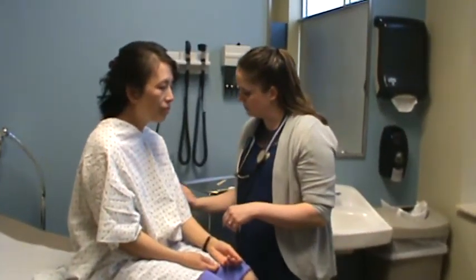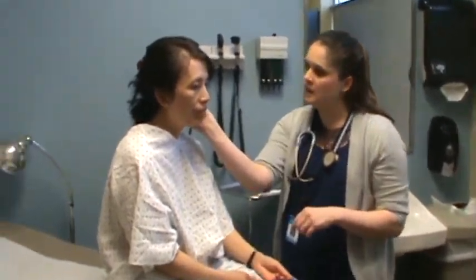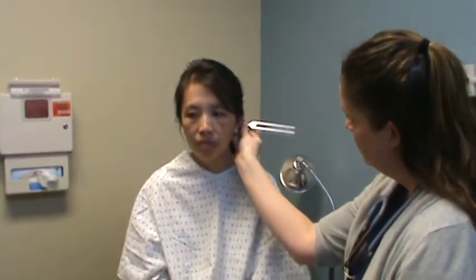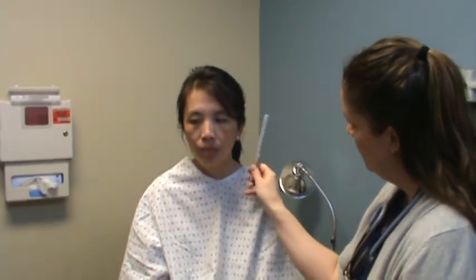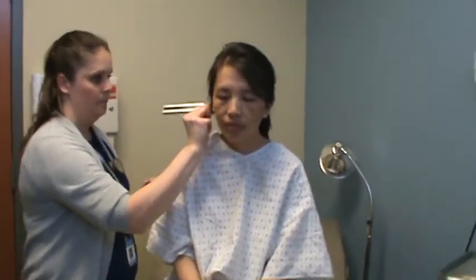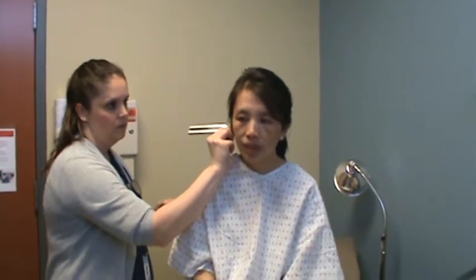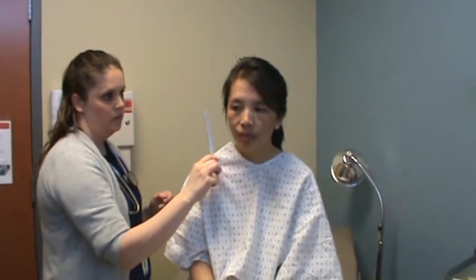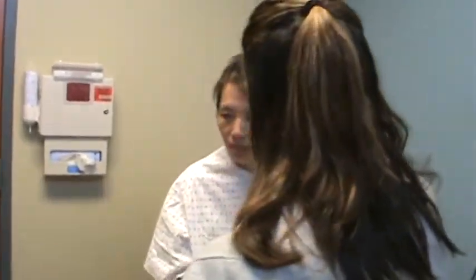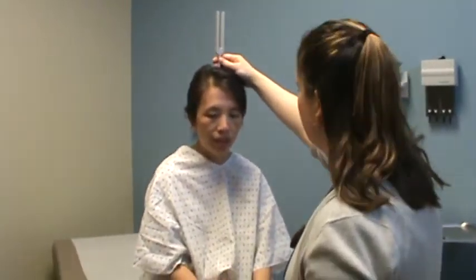And we're going to do a Rinne test now. I'm going to put this tuning fork up to you, and I want you to just let me know when you feel the vibration stop, or you can't hear it anymore. No. Okay, can you hear it? Yes. Okay, we're going to do the same thing on this side. Can you tell me when that stops? The ringing. No. Okay, can you hear it? Yes. Okay, good. And we're going to do a Weber's test. And just let me know if you can hear that bilaterally on both sides equally. Both sides, yes. Okay, good.